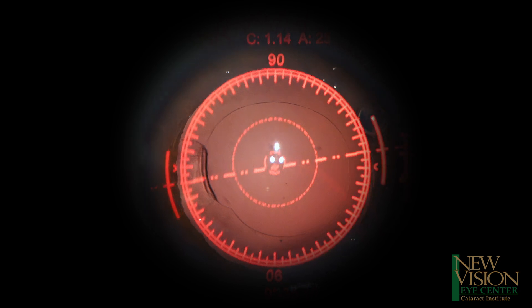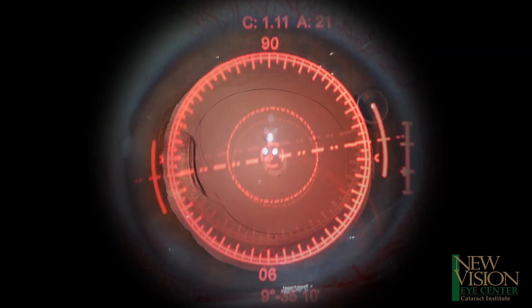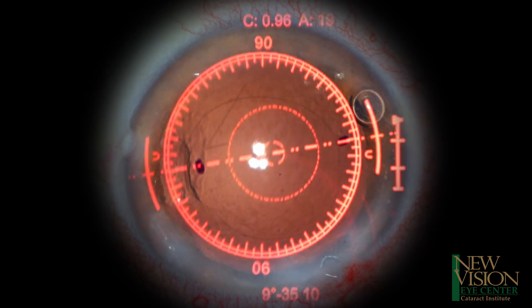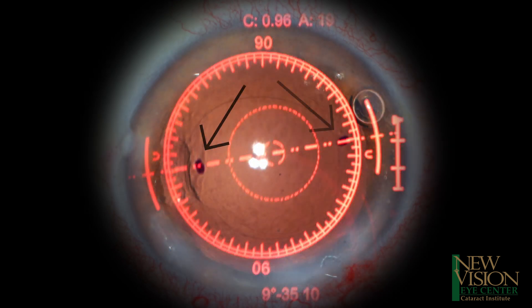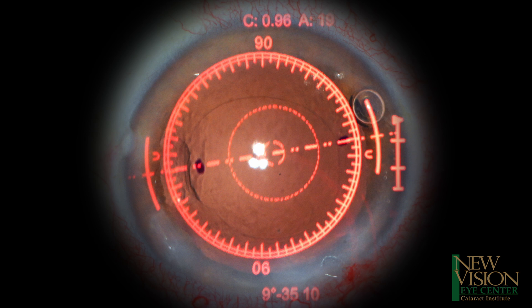Through the surgical microscope, the system provides a graphical overlay which shows exactly where the lens should be aligned. Small marks are placed so that the lens alignment can be made once the graphical overlay is removed.